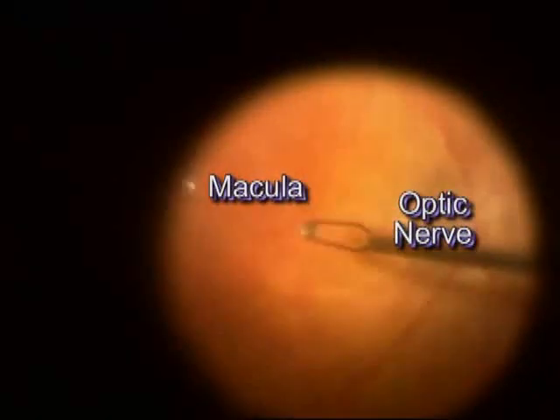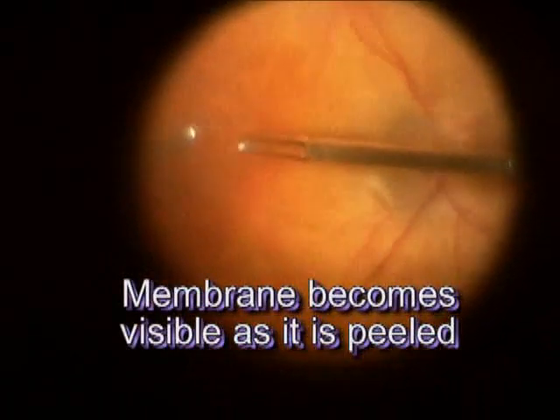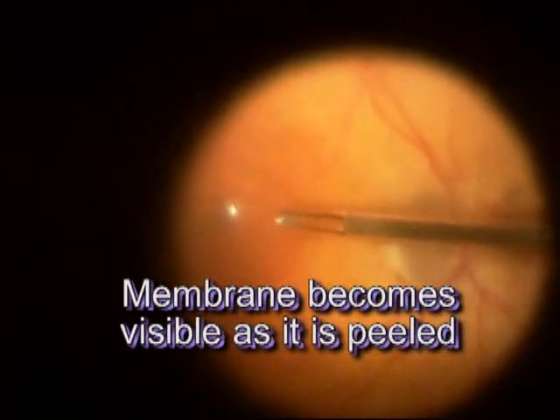On the right-hand side of the screen, you can see the 25-gauge forceps. Initially, as the macular pucker is pulled away from the retina, it's invisible. But once the edge of the macular pucker rolls up, you can see the macular pucker more clearly.